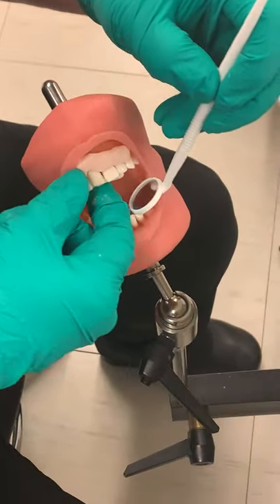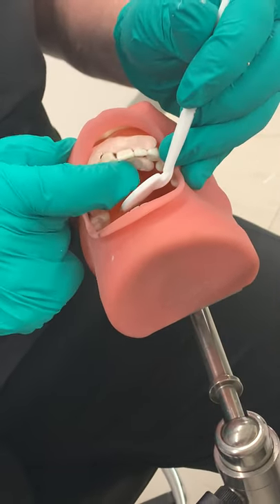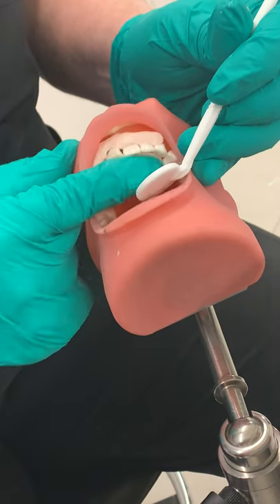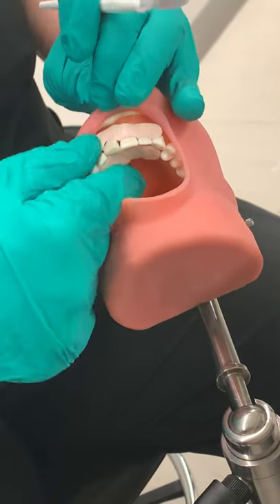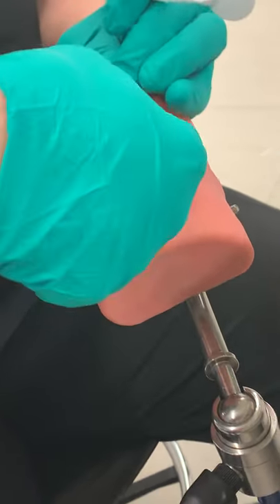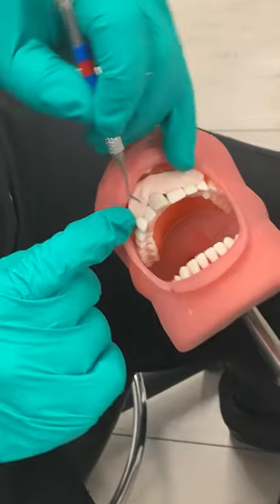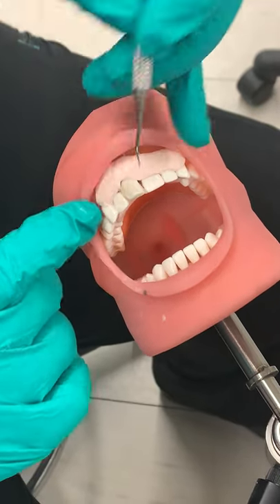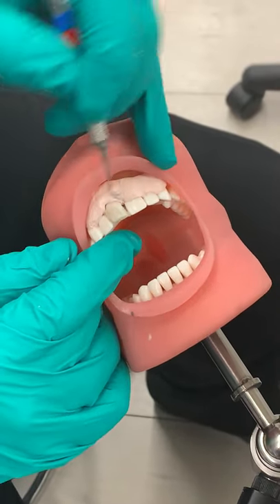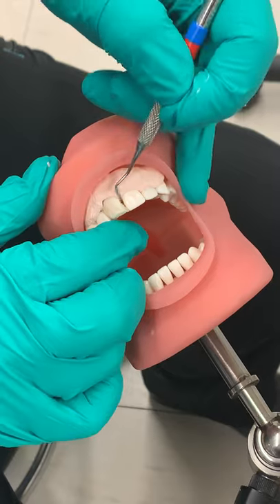Now I'm going to take my other little worm and put it on the lingual side and smash it in. Indirect vision comes in handy here. If it's too long you can go back and cut it later, but just get it on there and fix it after. The key is making sure it's locked interproximal — the lingual and the facial have to connect each other in between the interproximal spaces. That's where the half-Hollenback comes in to push it in between.